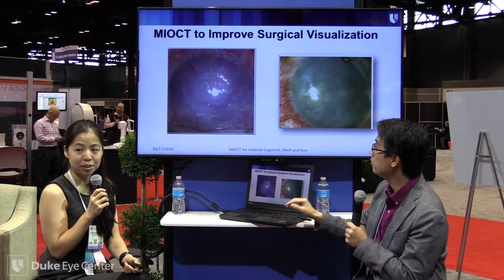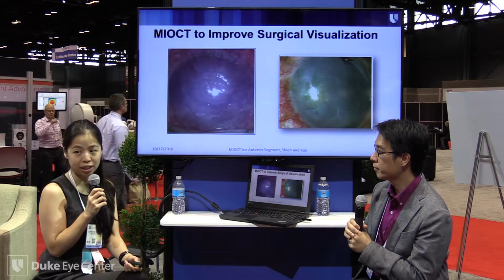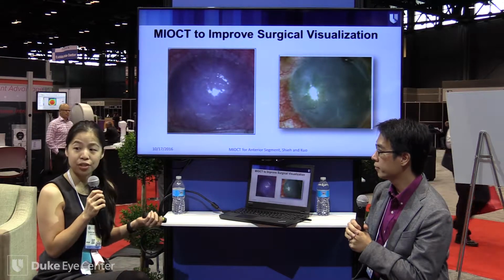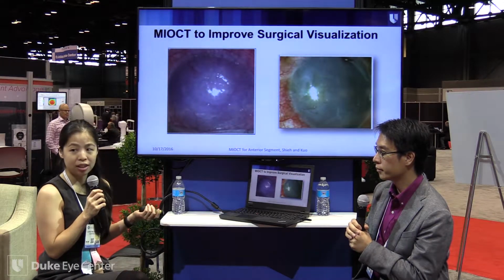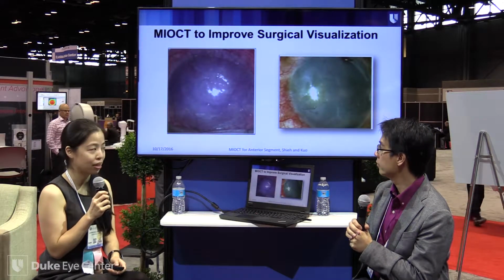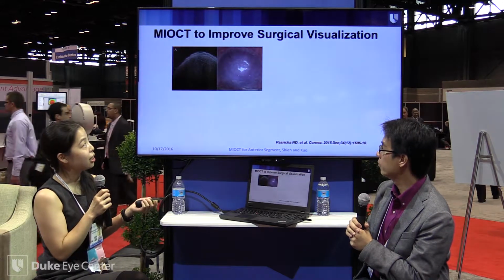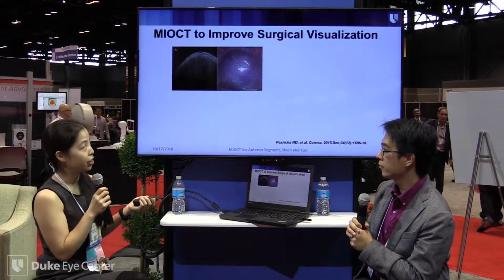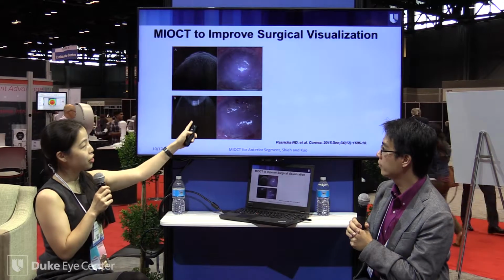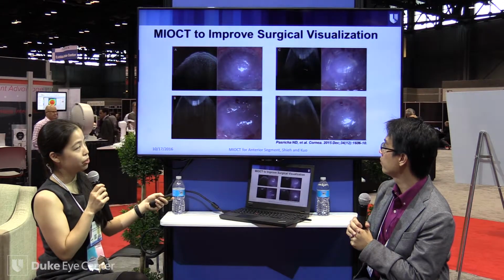And where OCT can potentially shine especially is in those severe cases of pseudophakic bullous keratopathy, where you basically have no view of the anterior chamber at all. These are two patients who had severe pseudophakic bullous keratopathy, and you couldn't see into their anterior chamber at all. And what we can see here is that with the use of microscope integrated OCT, it's possible to visualize the graft and also to be sure that the graft is opposed.